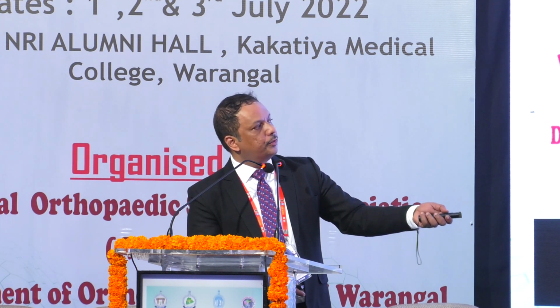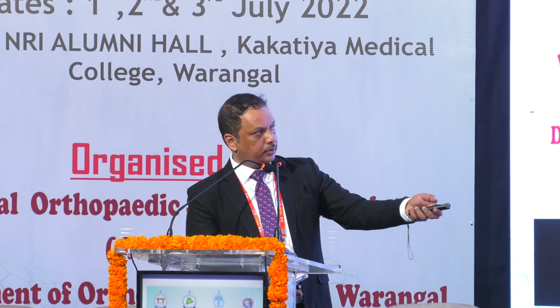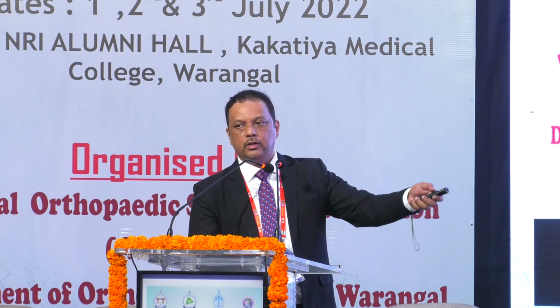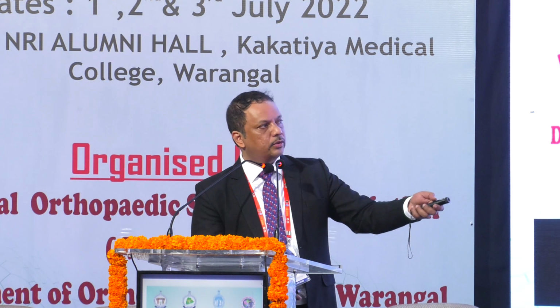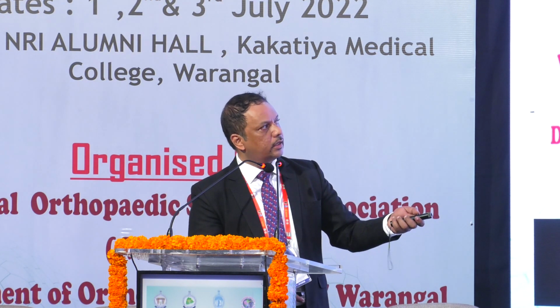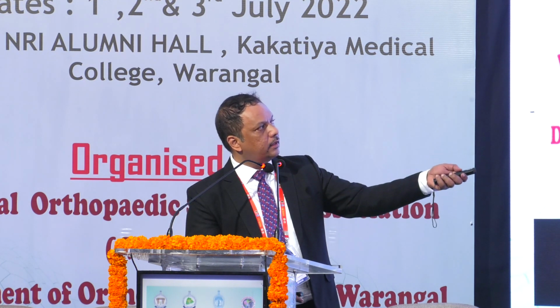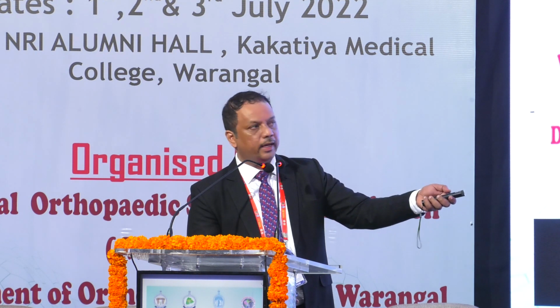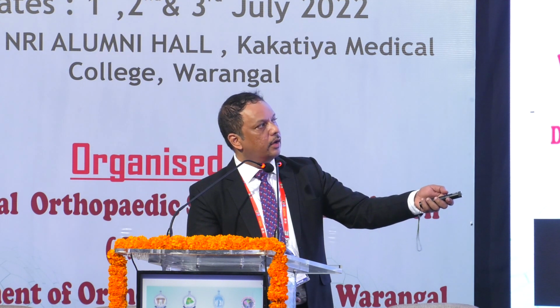So if you want, you can put an extra screw there at this point. After that, you can fix your plate onto that. So no need to hesitate on that. You can put a headless screw or even a cortical screw there. That extra screw there will hold on to this. Have at least 2 screws from your plate towards this lunate facet fragment. Very, very important there. Okay.